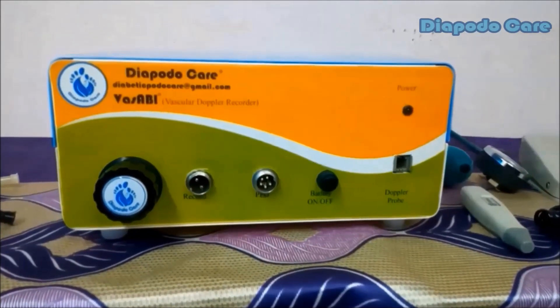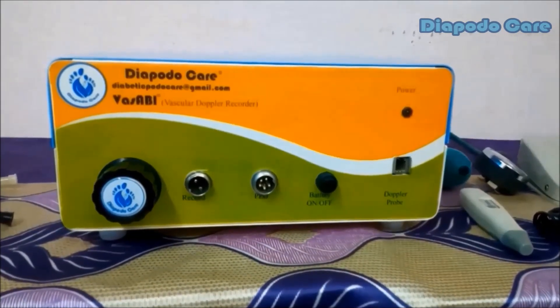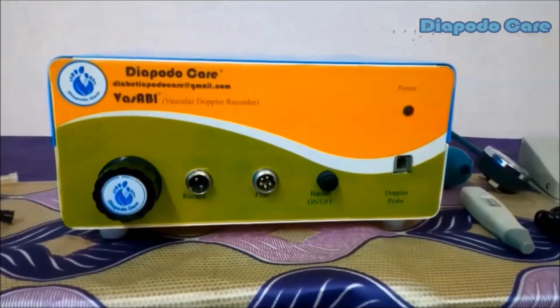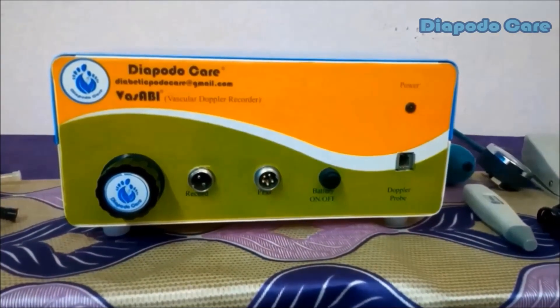Here we are going to see how to screen ankle brachial index and toe brachial index measurements of a diabetic patient using our Vassabi Doppler. We also demonstrate the operating procedure of Vassabi Doppler PC software and how to generate the patient's screening reports.